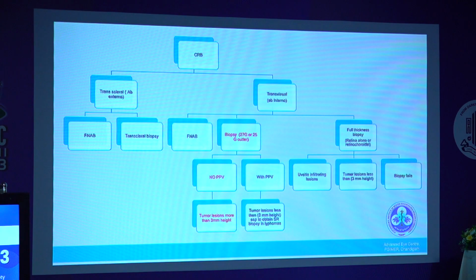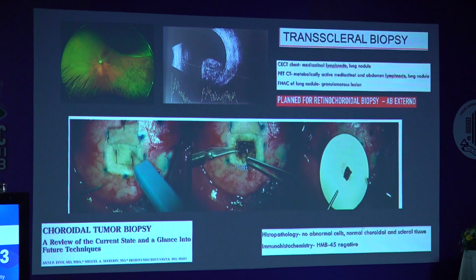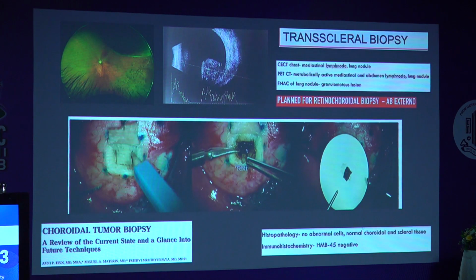There's a filter paper you are using, no? In your sample, you print it out on a filter paper? Yeah, we'll take it on a filter paper, and then we have to put it in the special media there, and then send it to histopathology. Or it will just be sent in formalin actually.